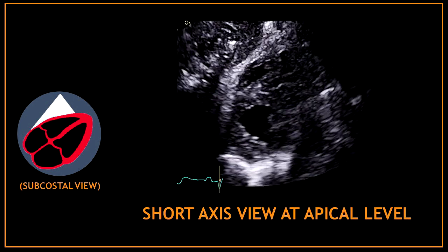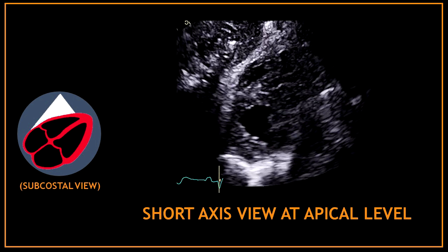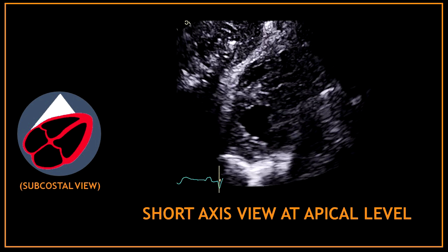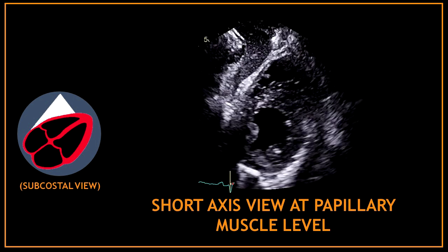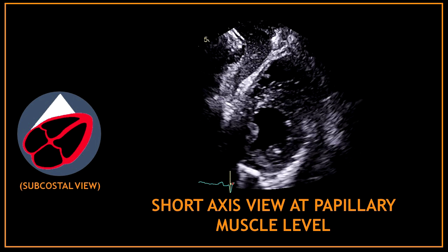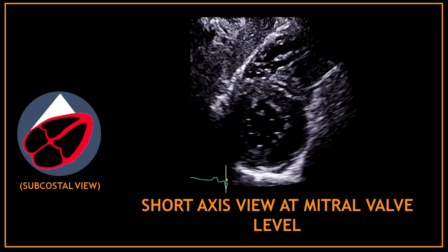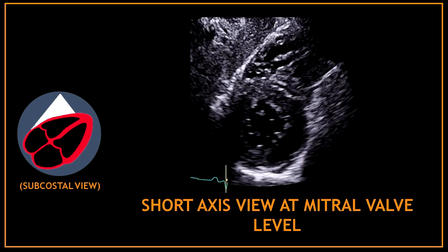By rotating the probe we can also obtain short axis views from the subcostal view. This is a short axis view at the apical level. You can also get a short axis view at the papillary muscle level, and even the short axis view at the mitral valve level — all this from the subcostal view.